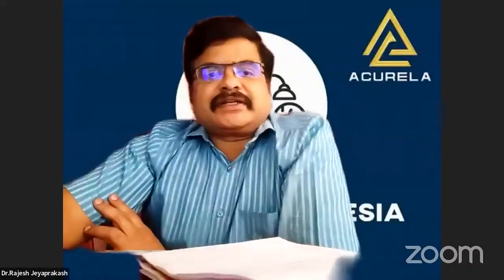What is the role of PAC over transesophageal echo? Is it reliable for cardiac output monitoring? Which one is reliable, the pulmonary artery catheter or transesophageal echo? Sir, it is not the technique whose reliability we actually compare. It depends more upon the clinical scenario of the patient. When you have a patient who is intubated and has complications, where we have to monitor the hemodynamic status, when transesophageal echo is available, I would first start off with the transesophageal echo.